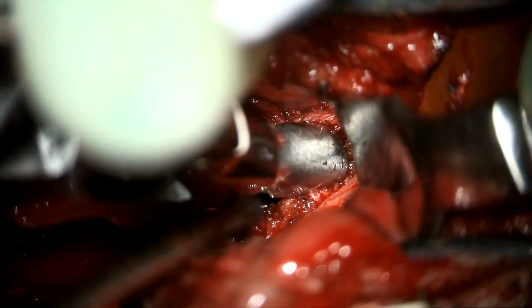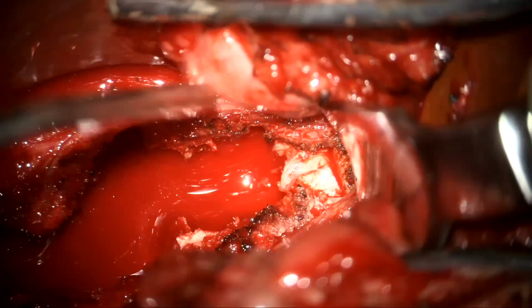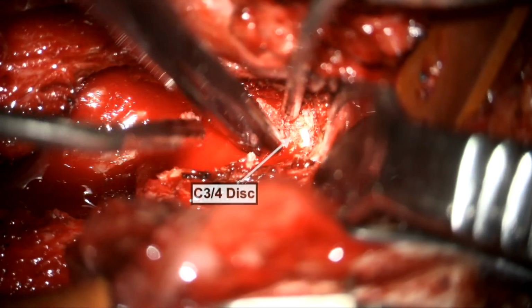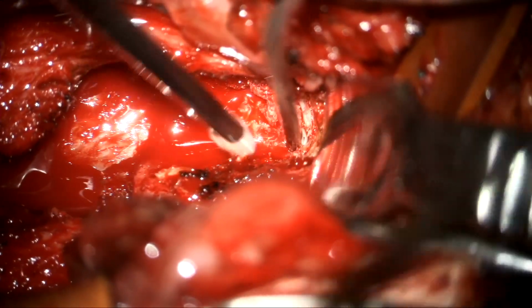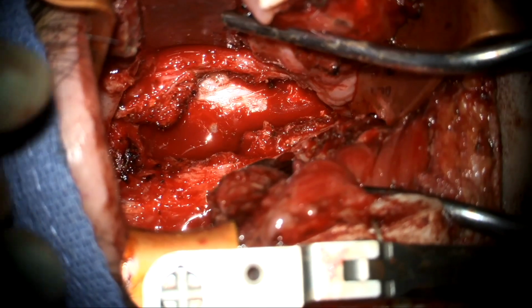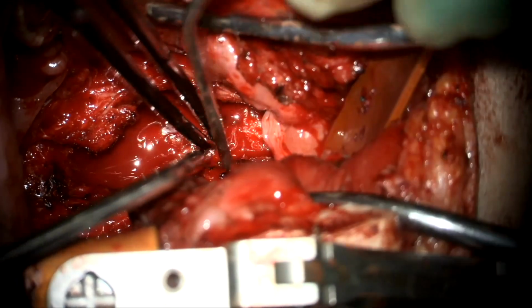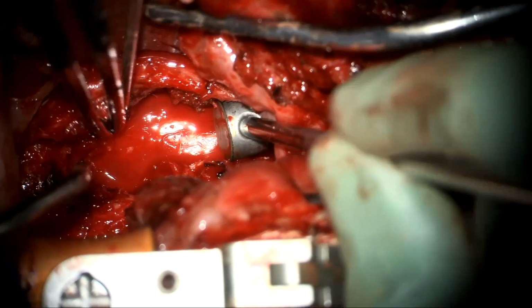For orientation, the left side of the screen is cranial and the right is caudal. Next, trial cages were used to size the corpectomy cage. The corpectomy cage was fit to the C2 to C4 defect, packed with allograft, and expanded.